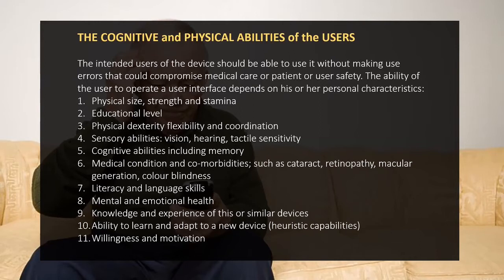But the people I was talking to were saying, well, no, actually, I'm used to texting, and I'm very happy with using a touchscreen interface, something more like a mobile phone touchscreen, which I absolutely hate. So it was just interesting, those different comparisons, and just what level of assumptions can you make about the user?